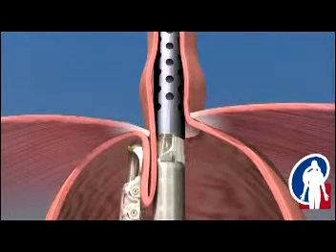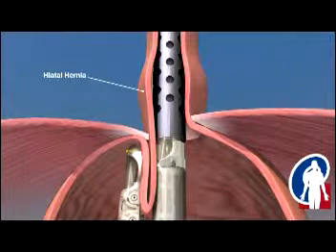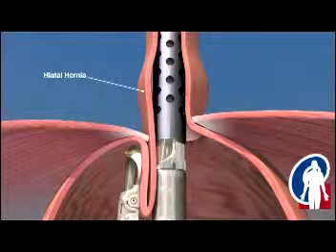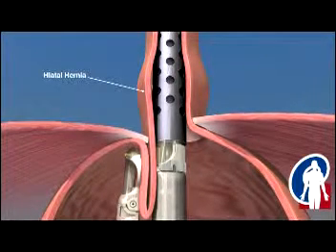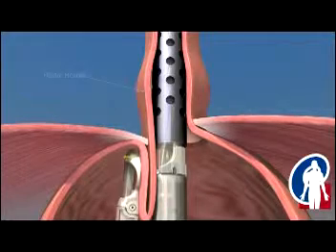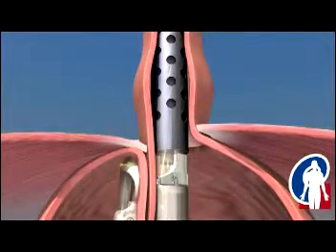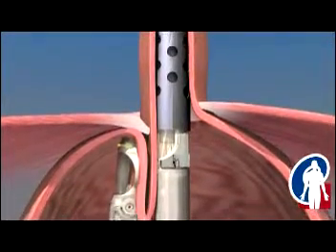Some patients may have a small hiatal hernia, a condition where a portion of the stomach has migrated up through the diaphragm into the chest cavity. If present, hiatal hernia can be reduced and the esophagus can be lengthened by retracting the endoscope up into the esophagus. Suction is then engaged, and the stomach is then repositioned down below the diaphragm.